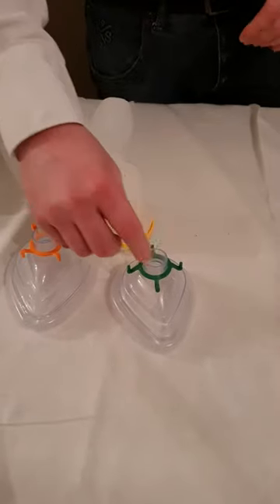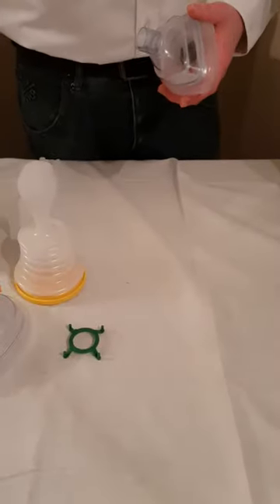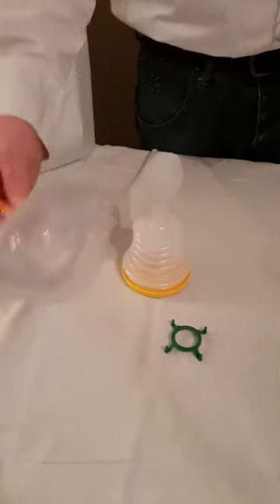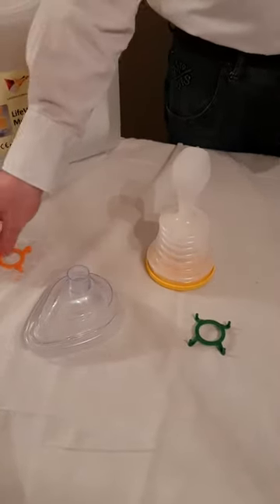Now, I know Charlie's facial features, so I know it's going to be a medium adult mask, which is clearly identified by a green color-coded ring. If you had bigger facial features and a broader nose, it would be a large adult mask, clearly identified by an orange color-coded ring. To put the mask into the LifeVac, simply twist and push.